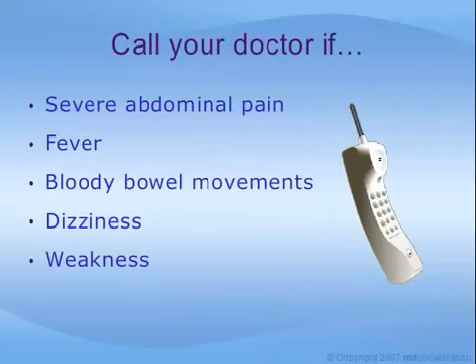Please read your discharge instructions given to you by your doctor carefully. Medications such as blood thinners may need to be stopped for a short time after having a colonoscopy, especially if a biopsy was performed or polyps were removed. Full recovery by the next day is normal and expected, and you may return to your regular activities. Rarely, some people will experience severe abdominal pain, fever, bloody bowel movements, dizziness, or weakness following the procedure. If you have any of these side effects, contact your physician immediately.